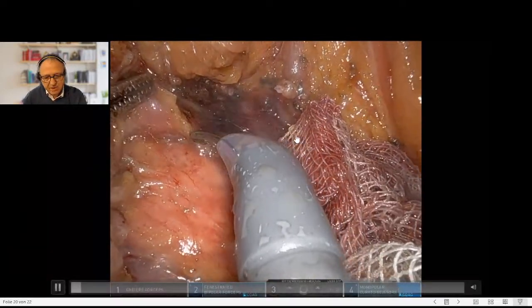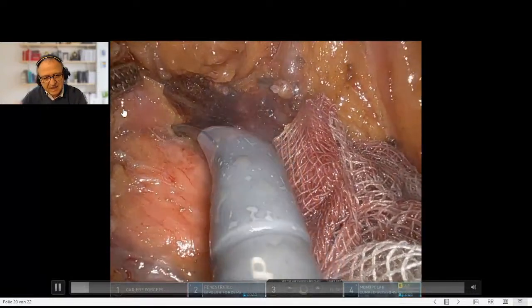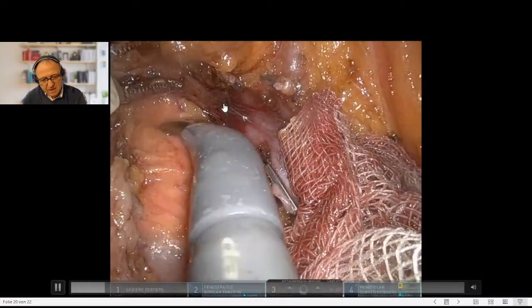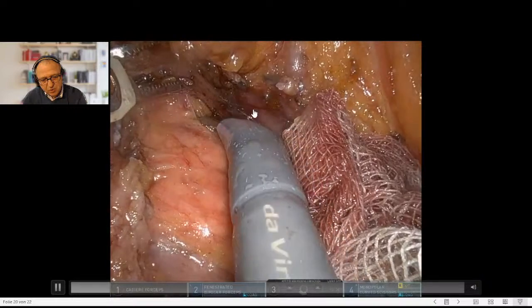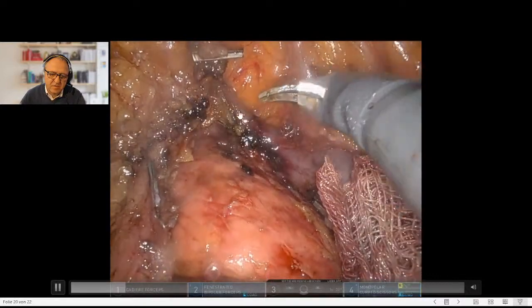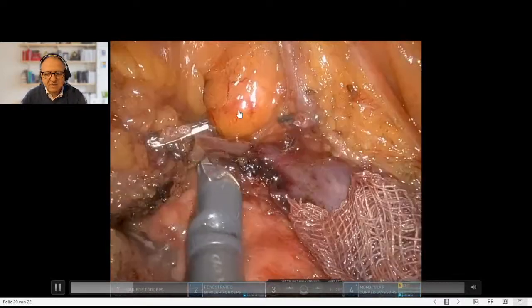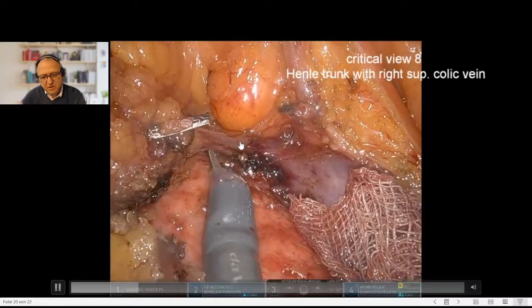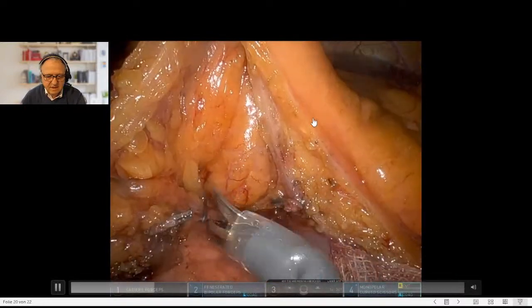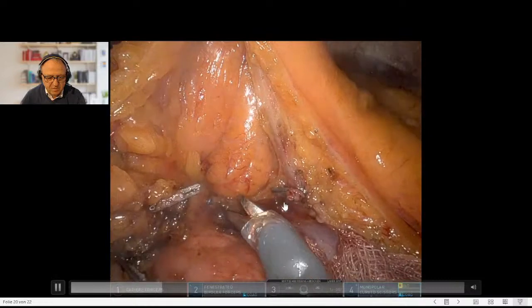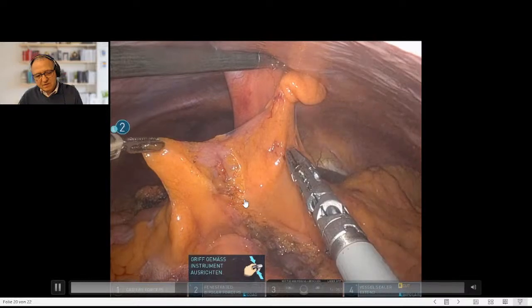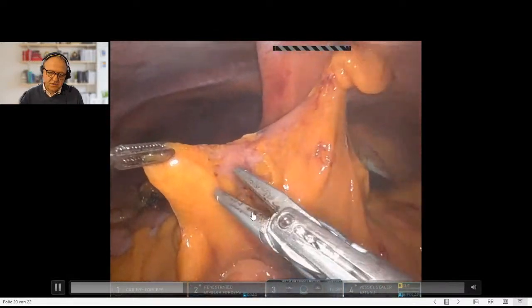Here the pancreatic head, Henle trunk is up here. You see one lymph node I try to dissect out. That's the reason why I go somewhat dorsal to the Henle trunk. All the lymphatic tissue is mobilized. The last vessel that remains is the superior right colic vein, Henle trunk, and the SMV. Here you can see the right branch of the middle colic artery. That was the final step of the central dissection.